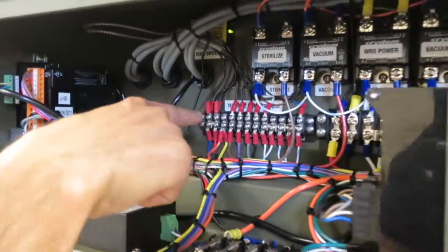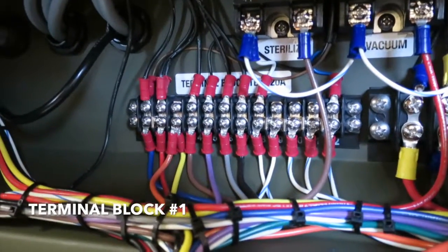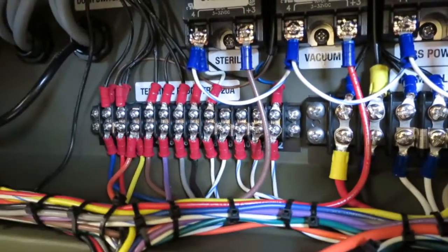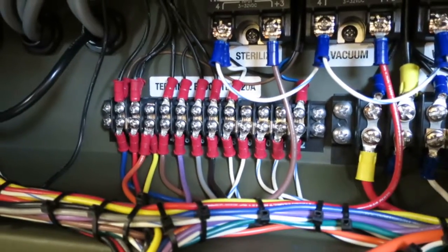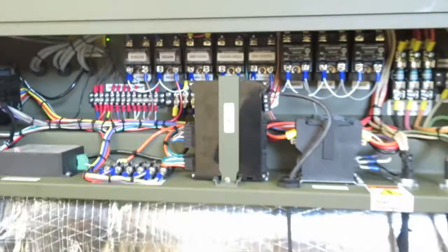Right here we have terminal block number 1, and a lot of that is the 24 volts and a lot of the connections to the valves and the transmitters throughout the unit. Alright, so that's it for the right side of the sterilizer main unit.